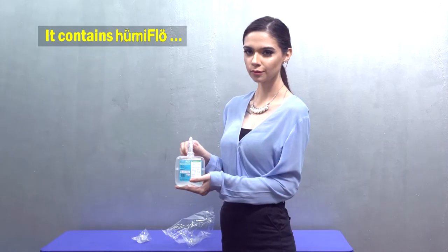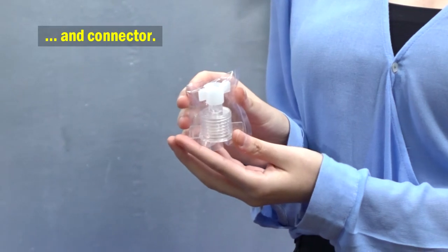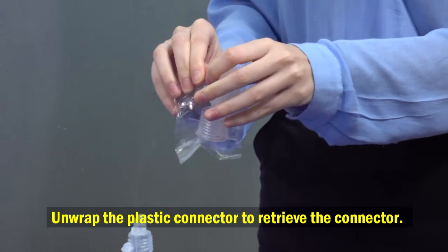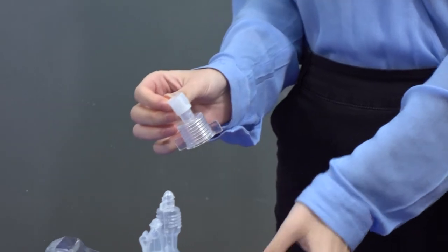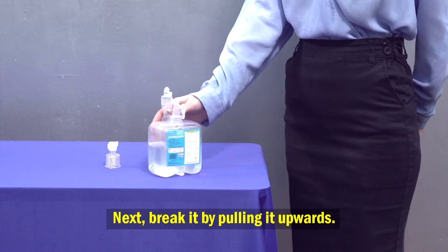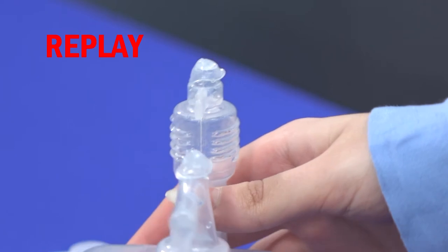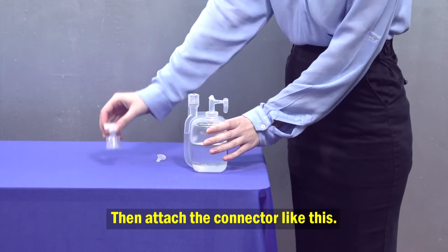The packaging contains Humiflow and the connector. Unwrap the plastic connector to retrieve the connector. Next, break it by pulling it upwards, then attach the connector to the Humiflow unit.